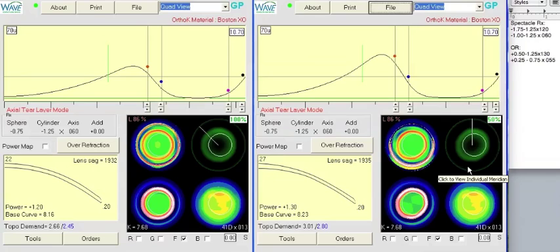I don't know, and that is one of the challenges that's going to make this idea, I think, difficult to implement. Could the patient possibly just wear this lens while awake for a week and induce stable toricity to the cornea, at which point perhaps a diopter and a quarter of corneal toricity can keep a non-ballasted lens in place?